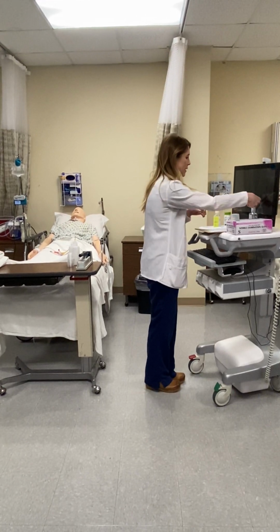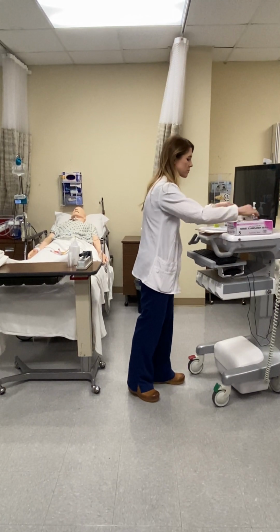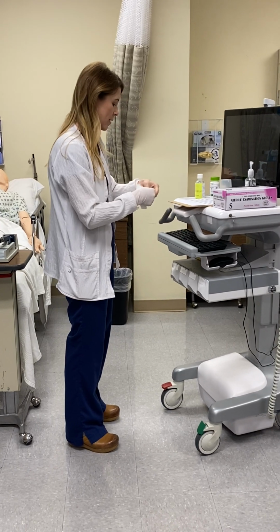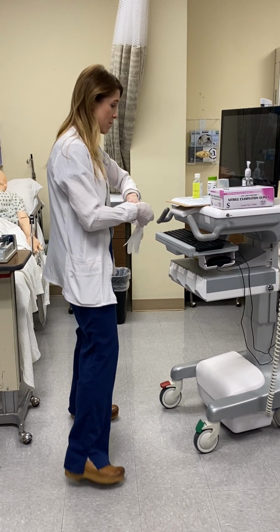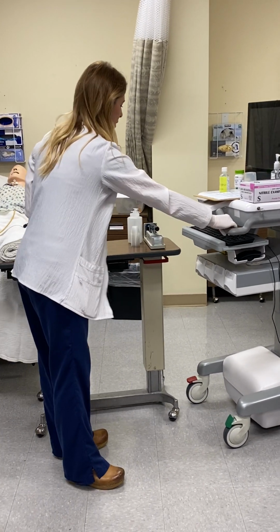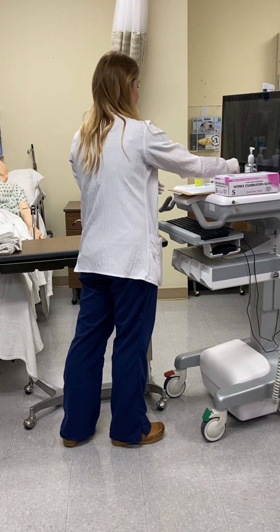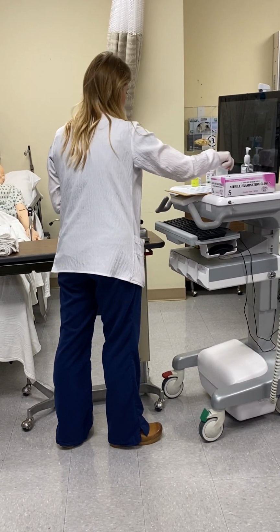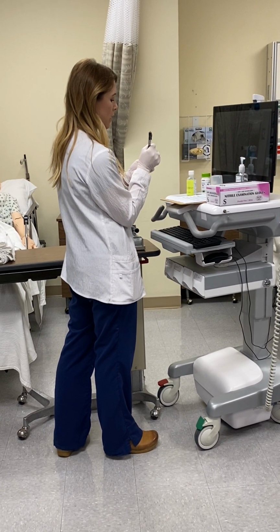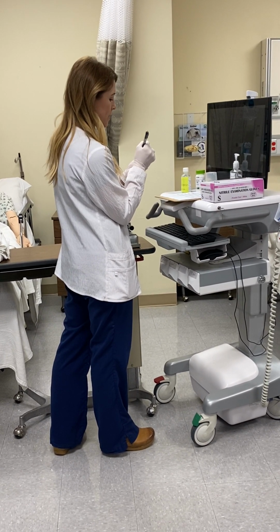So to get started, because I'm going to take them out of their packaging, I'm going to wash my hands and put on some gloves. And let's act as if I'm in the med room and I got everything I need here. This is how I'm going to crush my med. Okay, so since I'm taking it out of its original package, I do have to label my cup. This is what I meant by having supply. So this is folic acid, 1 milligram, JS room 2.